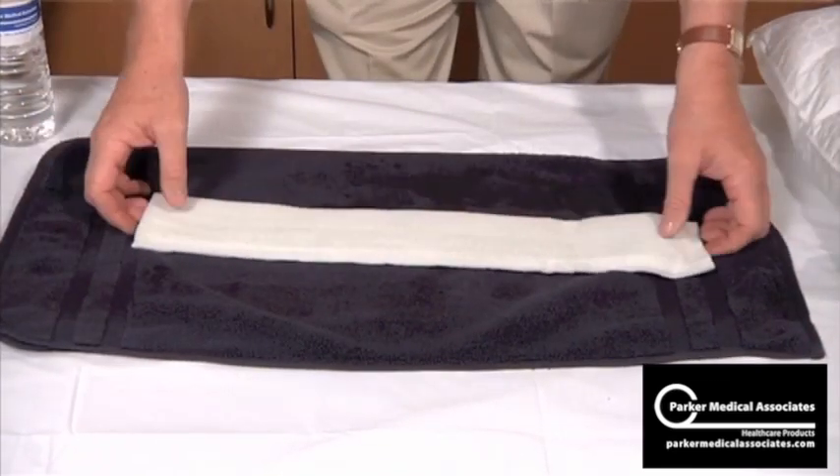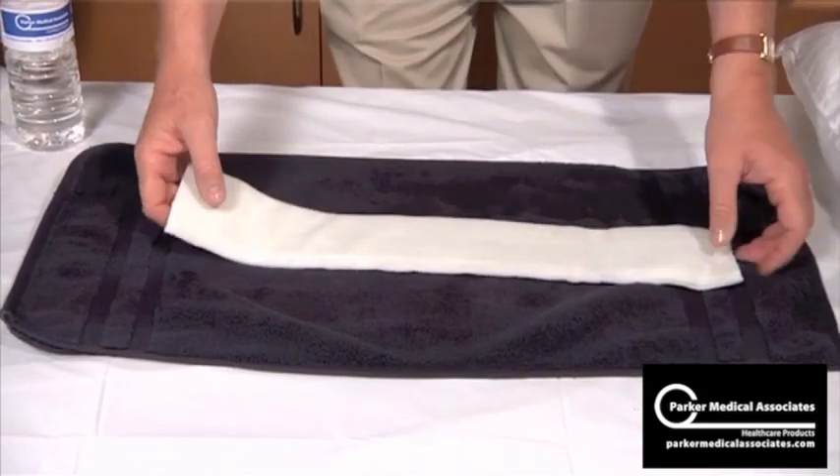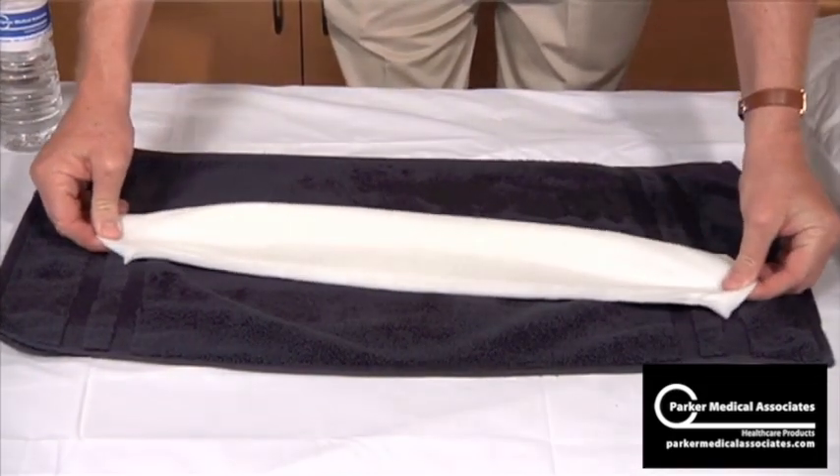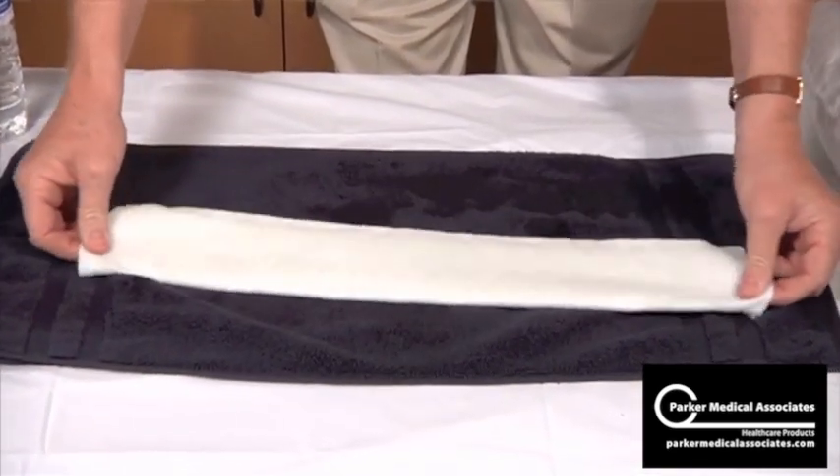Now remember to stretch the edges to protect your hands from the fiberglass. The best way I find is to grab both ends at the same time, stretch, turn, and stretch.